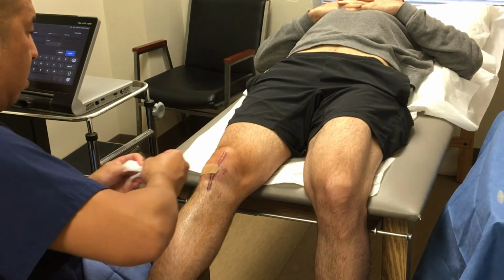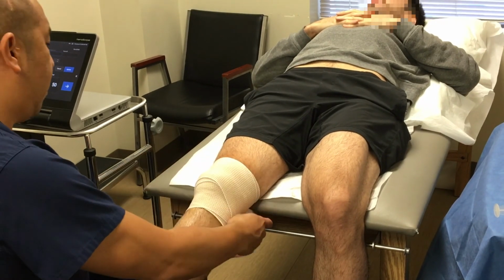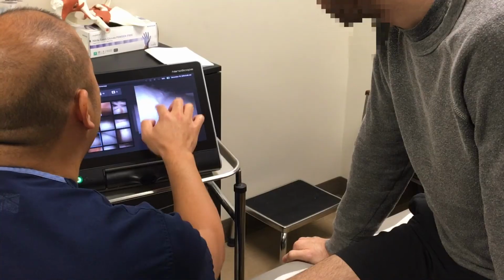and wrap it with gauze and ACE wrap. This is an in-office procedure which requires local anesthetic only. It's nice because the patient is awake and actually can see their images.